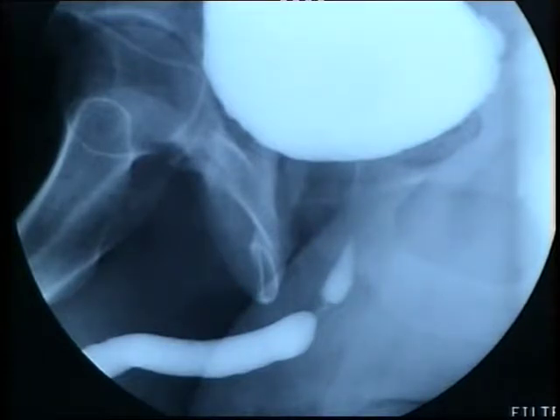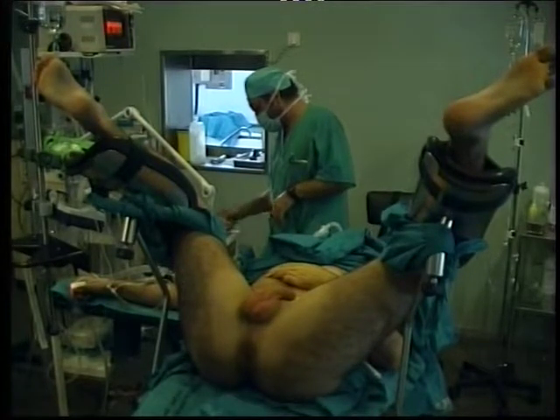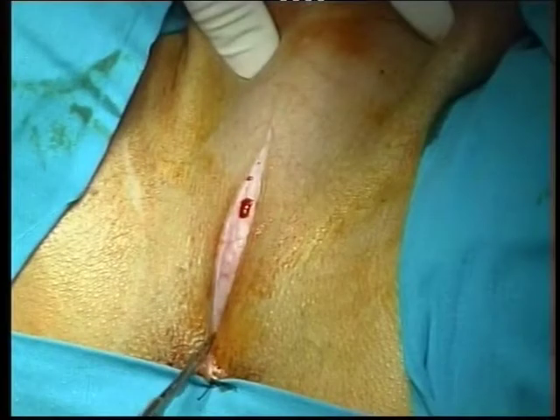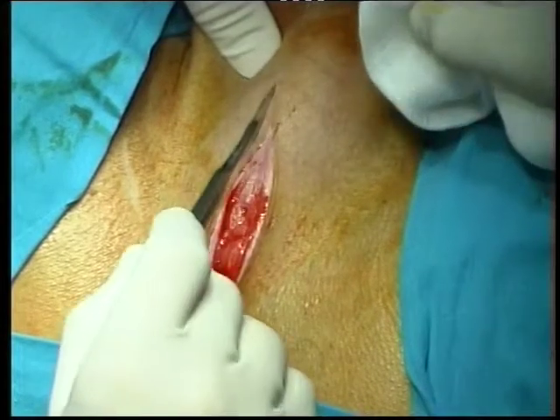Stricture excision and end-to-end anastomosis is the surgical technique of choice in these cases and offers 95% optimal results. Patient position is of utmost importance. The exaggerated lithotomy position exposes perfectly the perineum and allows the dissection of the deep proximal bulbar urethra.